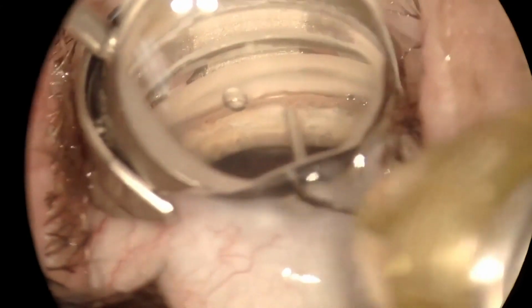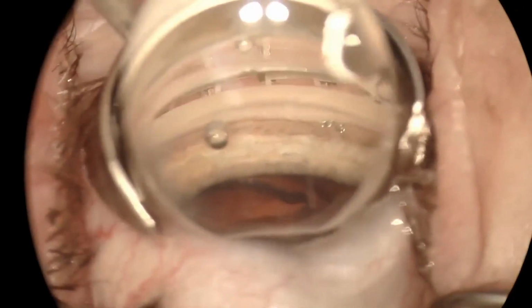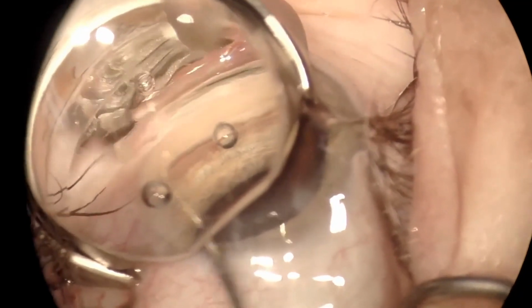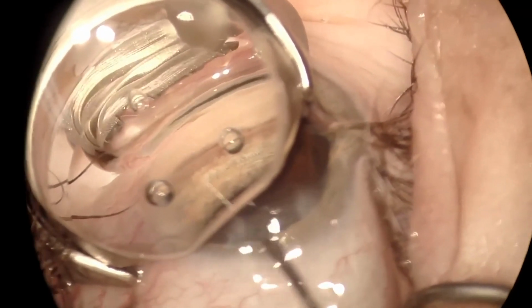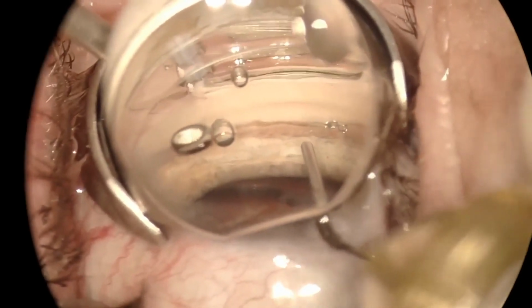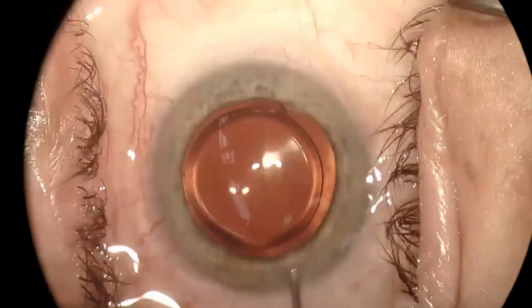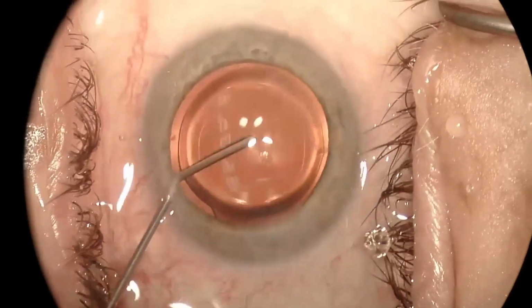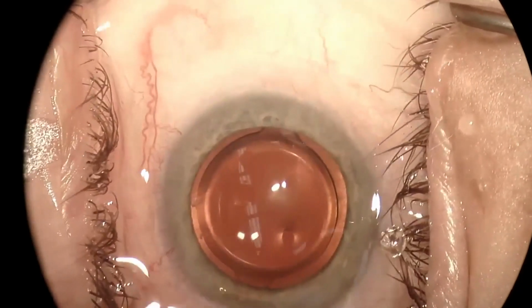You can see the stretching of the trabecular meshwork, and it's slowly advancing the stent. I'm going very slow, very purposeful, watching the leading edge of the stent, and now as I retract it, I have to pull back a little bit to my right just to make sure I don't disturb the stent. Now it's sticking out a little bit far, so what I use is a viscoelastic cannula just to nudge that last little bit of the stent into good position. When you do that, you put a little bit of posterior pressure, or pressure away from you, and then just gently follow the curve of the canal.